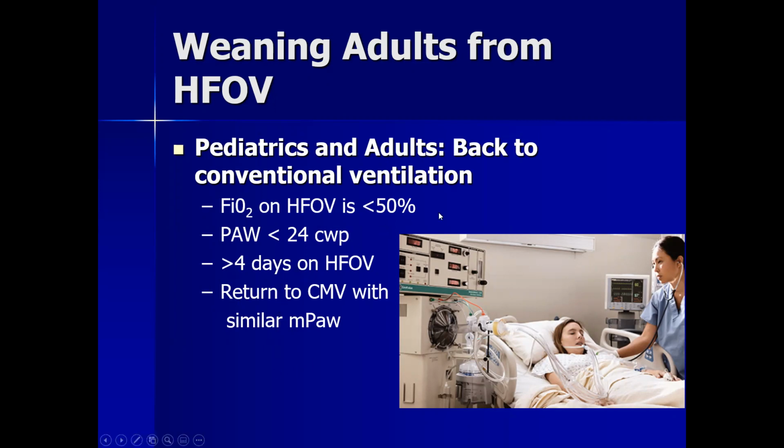It typically becomes whoever the intensivist is on call. So one intensivist will come on and put the baby on the oscillator. Then after what did they do? 24-hour shifts or 12-hour shifts. So they leave and then the next intensivist comes on. They don't like the oscillator. And then they switch them back to conventional ventilation. And it just goes back and forth like that. It'll drive you guys crazy.